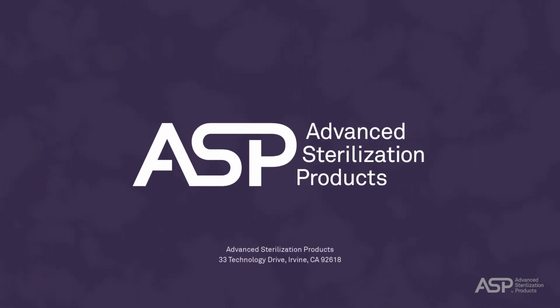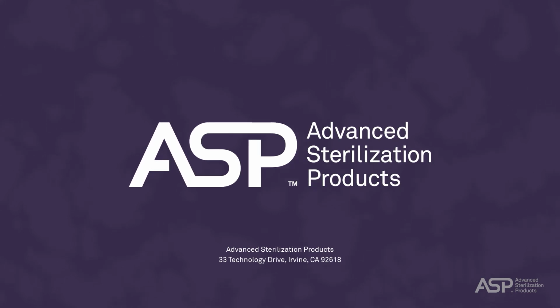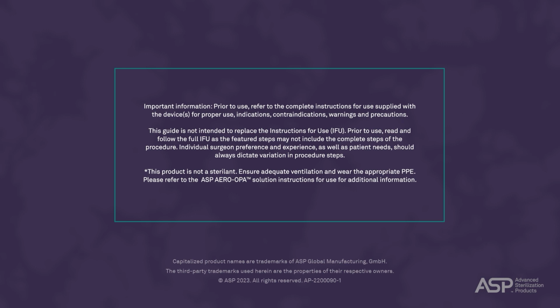This concludes our overview of the ASP AEROFLEX AER with AutoSure MRC monitor. For complete information, warnings, and instructions, please read and follow the user's guide before use.